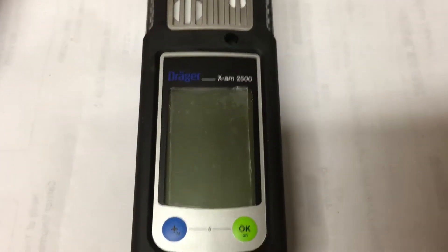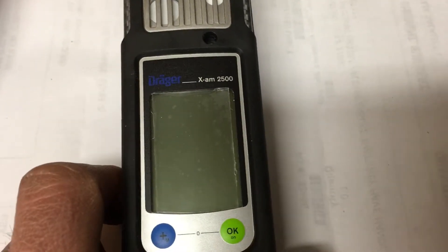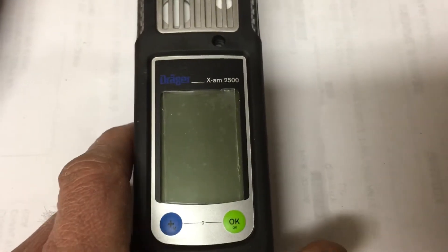This is a short video on how to turn on the X-am 2500 air monitor, how to do a fresh air cal with it, and then how to turn it back off.